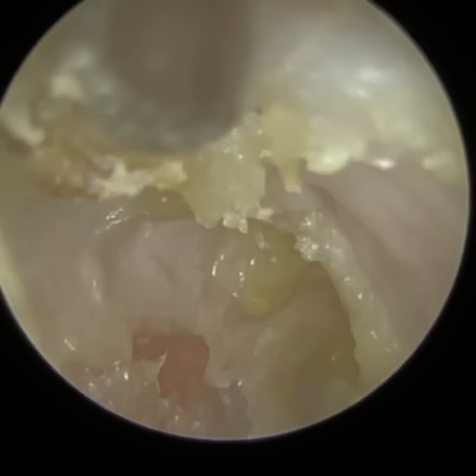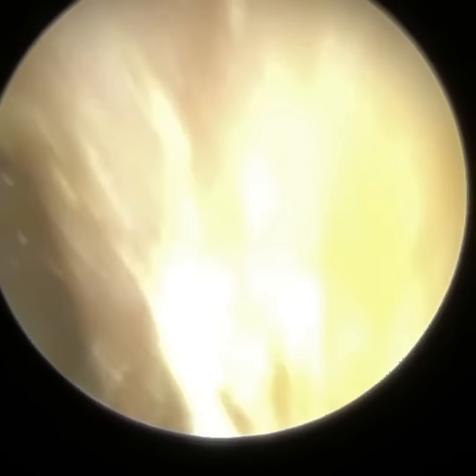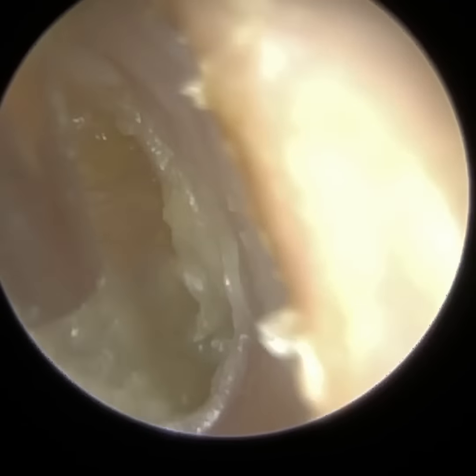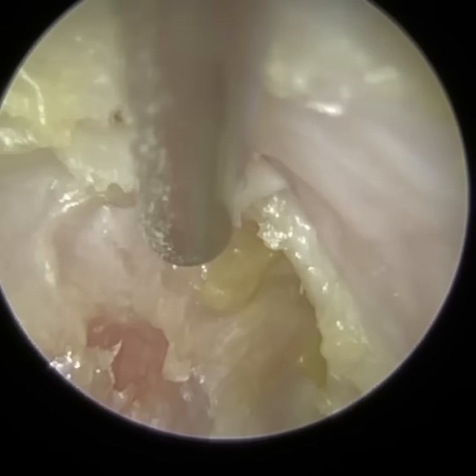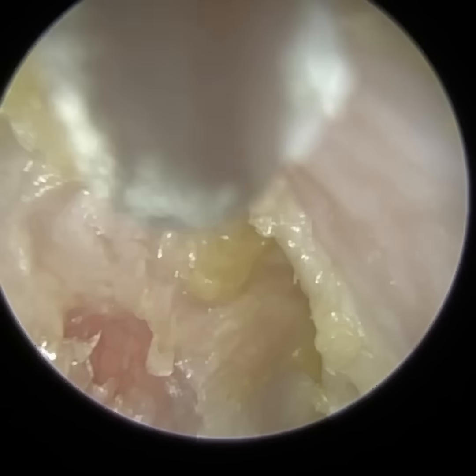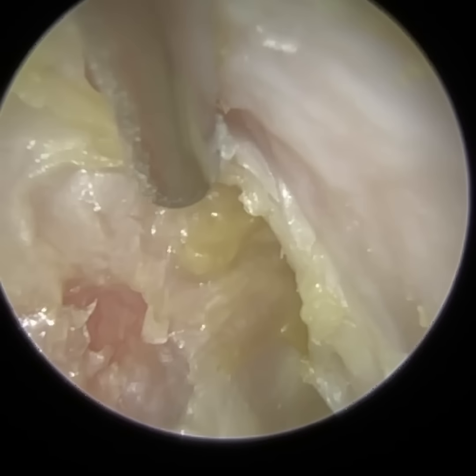So this patient initially felt that there was a fault with the hearing aid, and they had an appointment booked with their prescribing audiologist the following day, but prior to attending, they just wanted to get their ears checked just in case. And once we cleared this, they reinserted the hearing aid, and they could hear significantly better. So I've got a feeling they probably cancelled their appointment. They no longer needed it. So I'm just trying to peel this down.